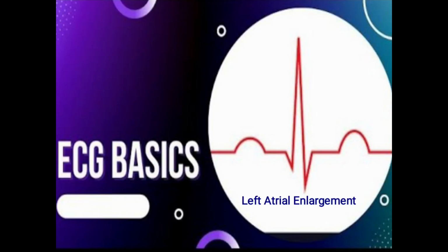Hi friends, today in this topic of ECG basics, I will talk about left atrial enlargement.